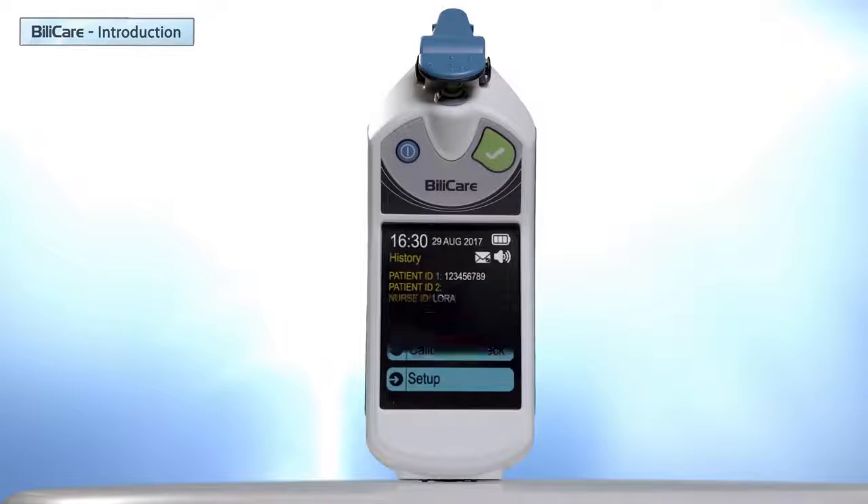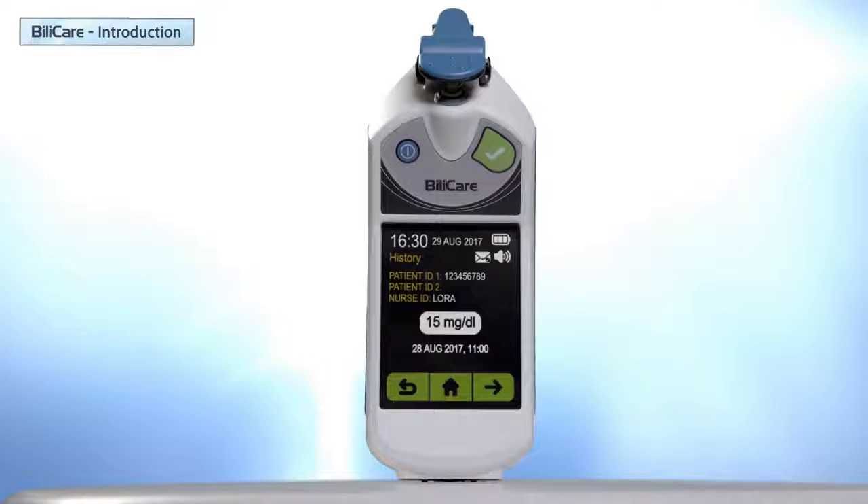Let's press Show Results. This is a history feature where you can see previous results. When entering Show Results, the most recent result is displayed first. Bilicare stores up to 40 dated measurements. You can easily go through the results by clicking next and back. Once the history list is full, a new result will replace the oldest one.